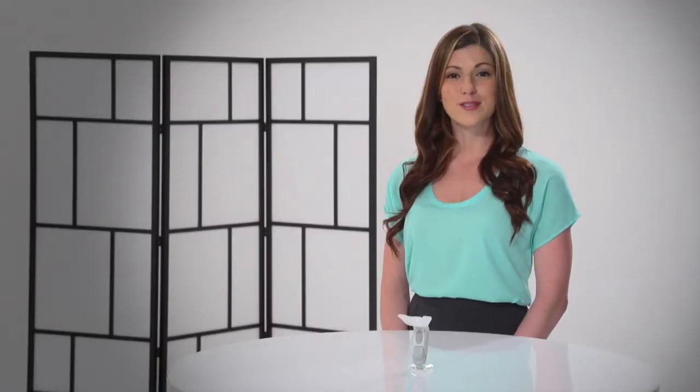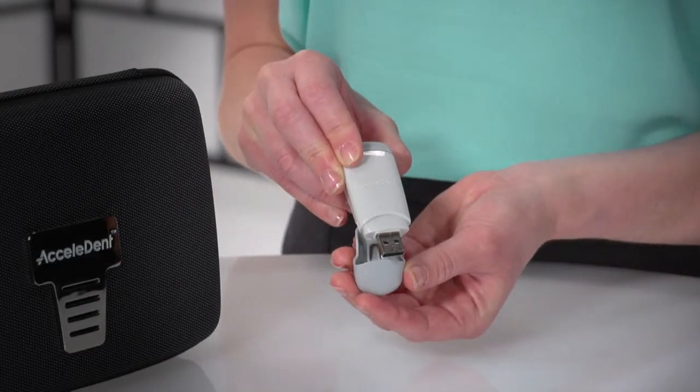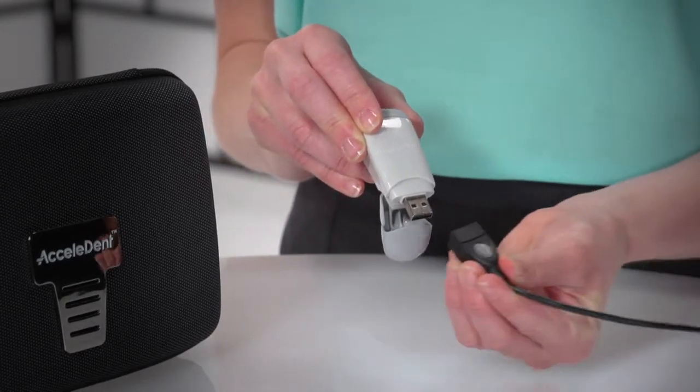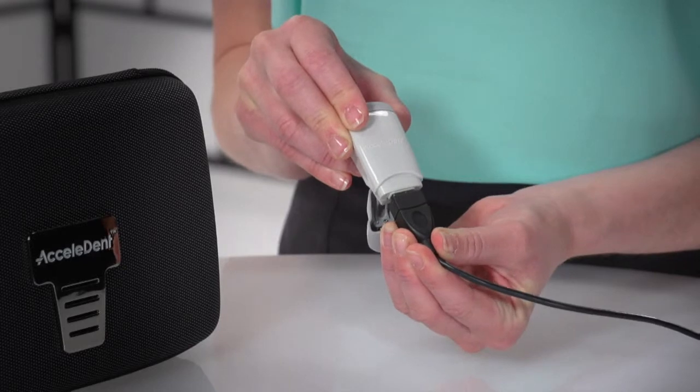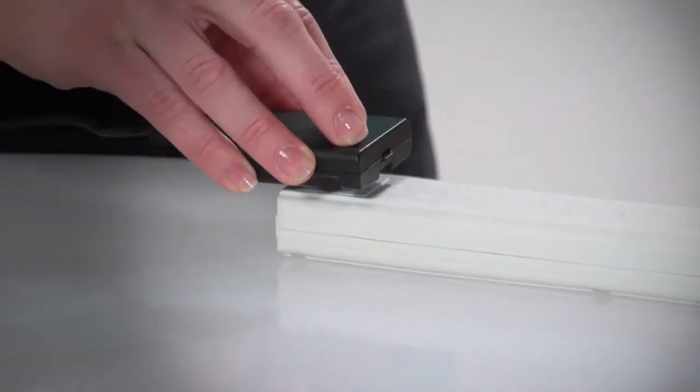Prior to first use, fully charge your Excelident Aura overnight. For subsequent charging, allow 2 hours for the battery to reach full charge. The activator is properly charging when it is attached to the power adapter and plugged into a powered electrical outlet.